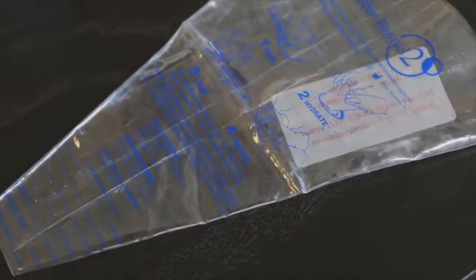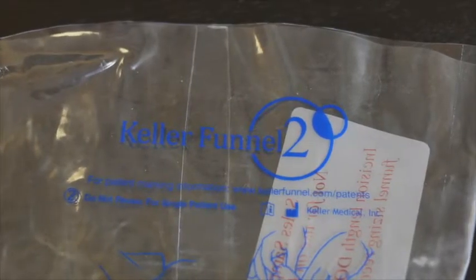Well, that seems like a lot less aggressive approach for putting in an implant. So I would think if I was a patient, I might want to ask my doctor if he actually used that device for implantation of an implant. I agree with you. I would want to know that too, because I think we're going to probably see a day where the Keller Funnel is kind of standard procedure for putting in breast implants, because the old-fashioned way, as it were, was just that we would manually insert the implant, and we'd have different ways of working the implant in there.